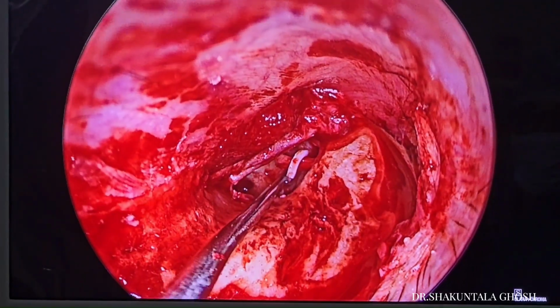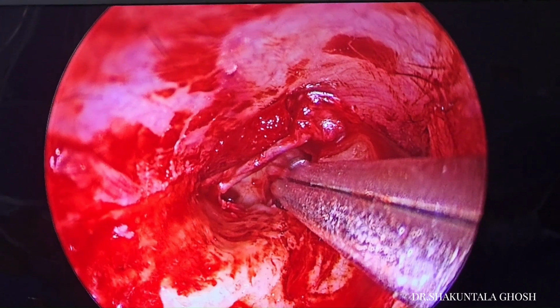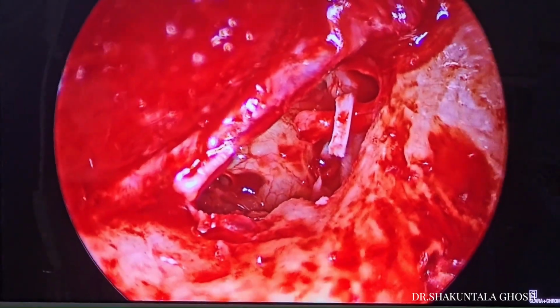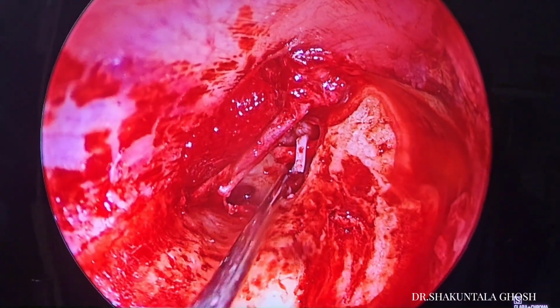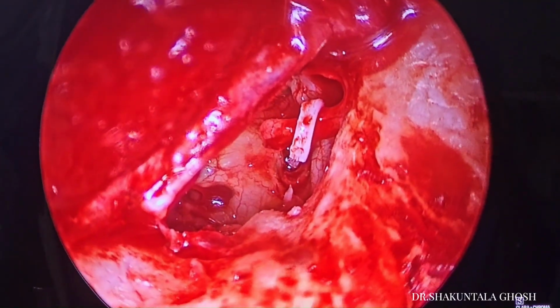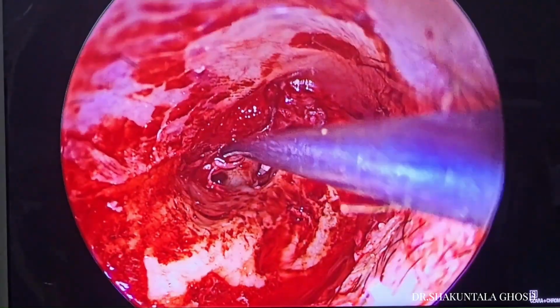At the same time, I am able to visualize the medial end of the Teflon piston also. It is fitting very well into the fenestrum. Now I crimp the Teflon piston using the alligator forceps, and again I ensure that the medial end is lying well within the fenestrum in the foot plate, and it is loose there. No, it should not be snugly fitting, it should be able to move well.